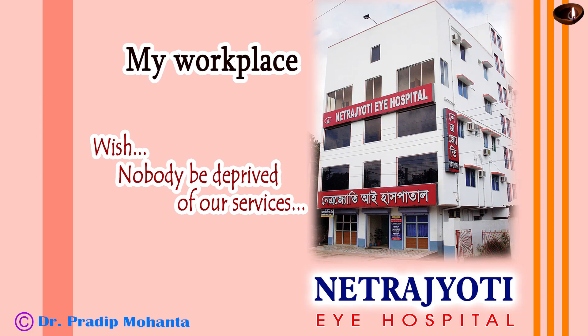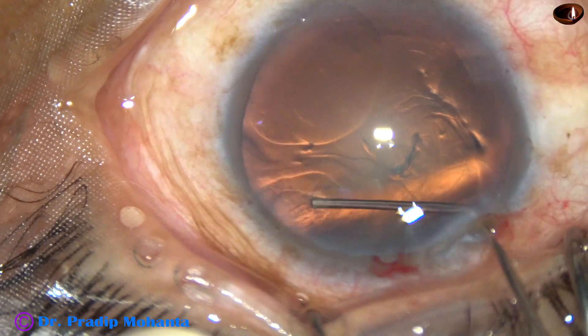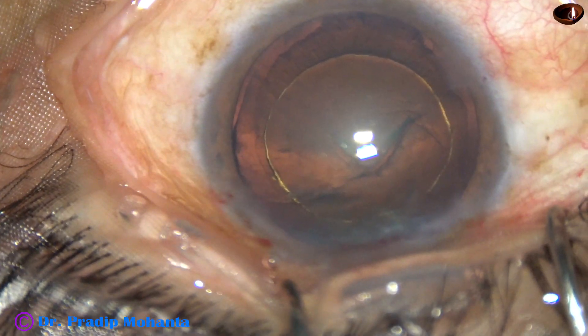Friends, welcome to my workplace at Ranaghat, West Bengal, India. In this video, I am going to demonstrate four soft cataract FACOs where chopper hasn't been used.